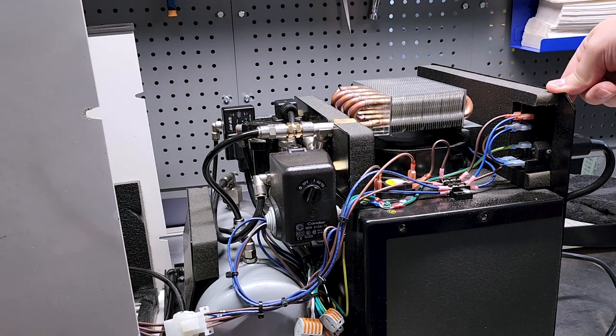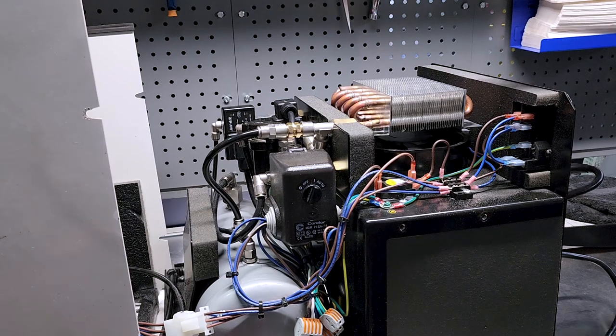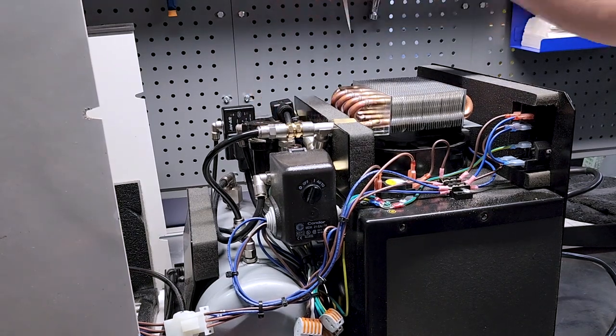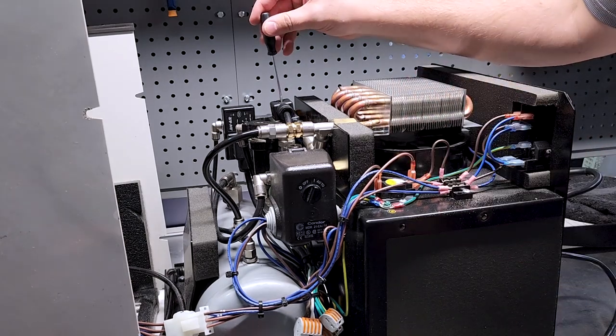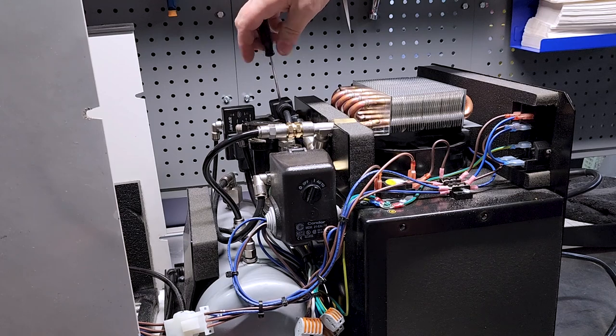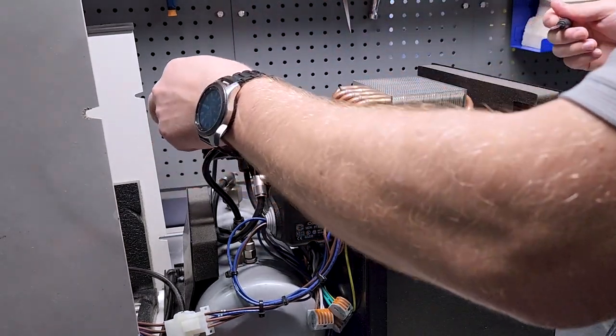Hear that? So that's not typical solenoid vibrations. There is something else going on there. And for safety's sake, let's go ahead and disconnect this guy. This guy right here, believe it or not, I've already gone through and seen what's really going on. So let's go ahead and disconnect this relay. This is the auto purge solenoid. So let's go ahead and disconnect him, sit him off to the side.